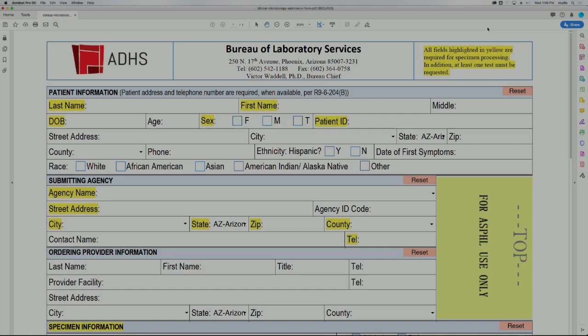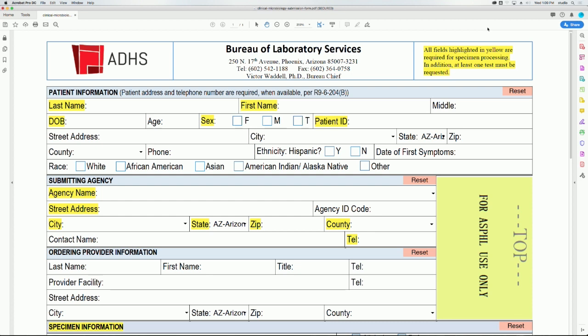Before starting, keep in mind that all information on the submission form must match the information on the specimen label. All fields highlighted in yellow are required to be completed for each submission.